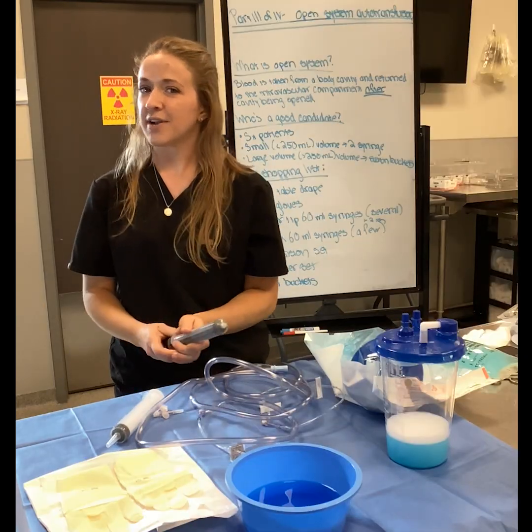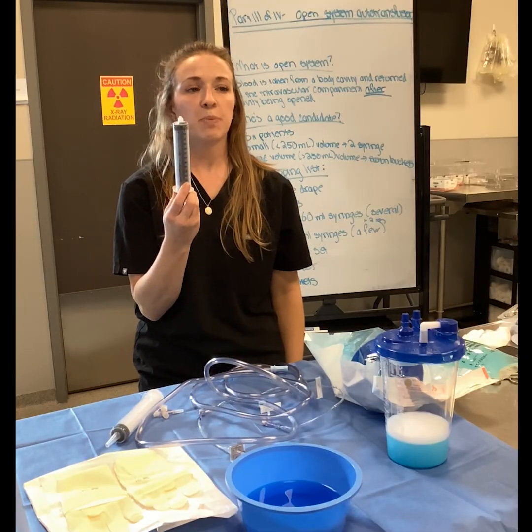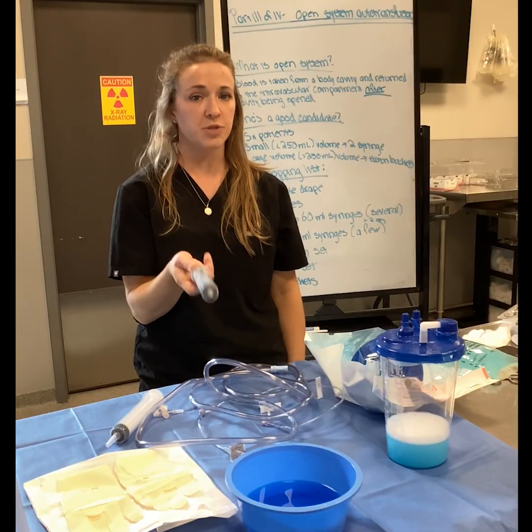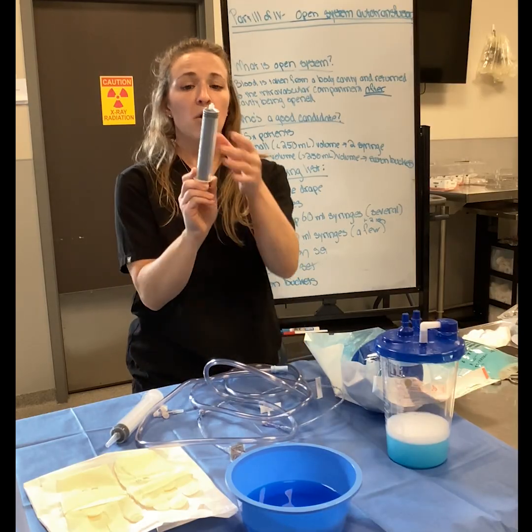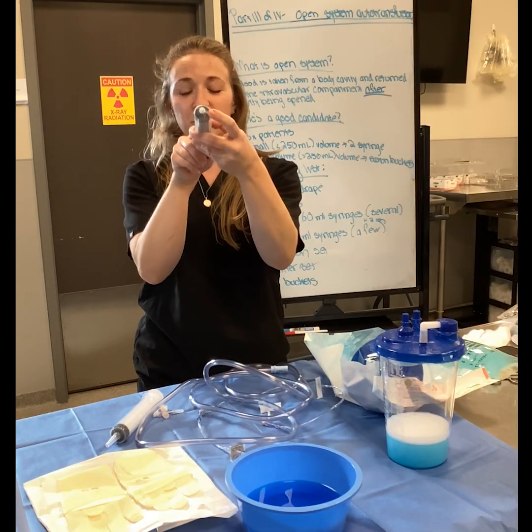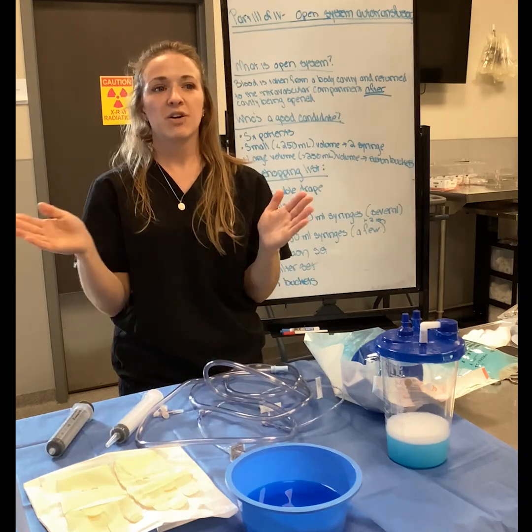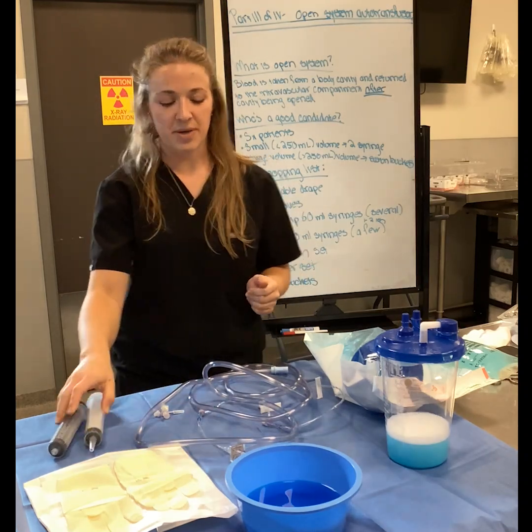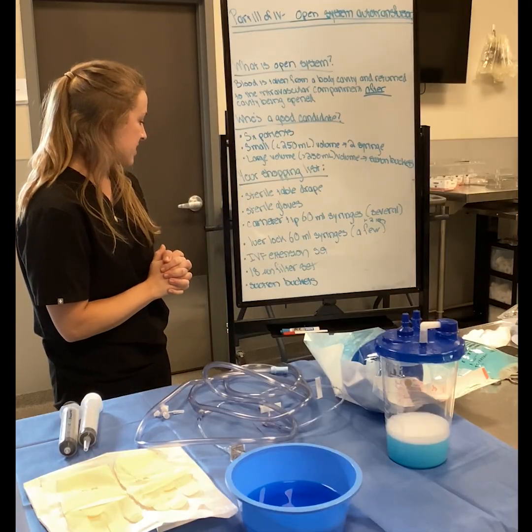You could certainly cut out the middleman and just do one of these, but I will say from personal experience, it's very hard to aspirate blood from the abdomen with this tiny little luer lock 60 because the mesentery and the omentum usually get trapped in there. So this is how we would do it. Let's see, what else do we need?